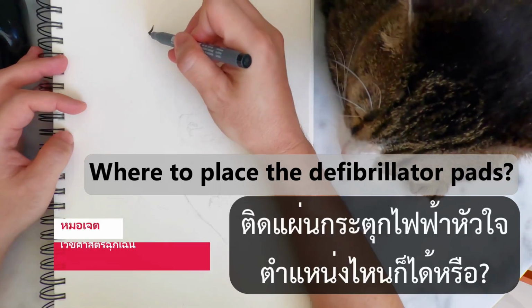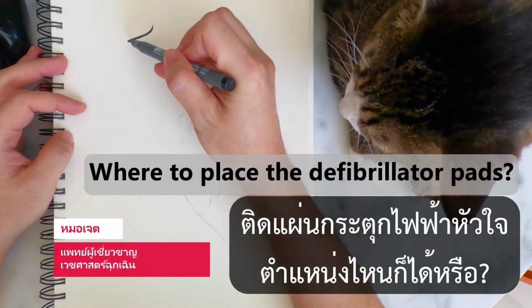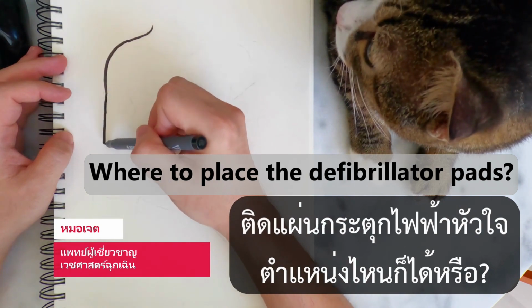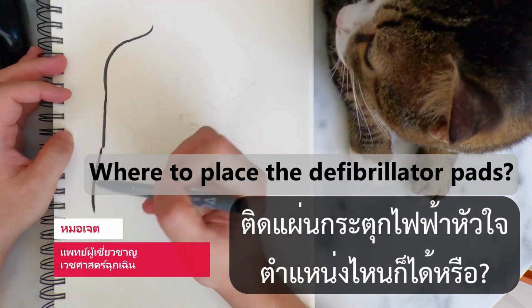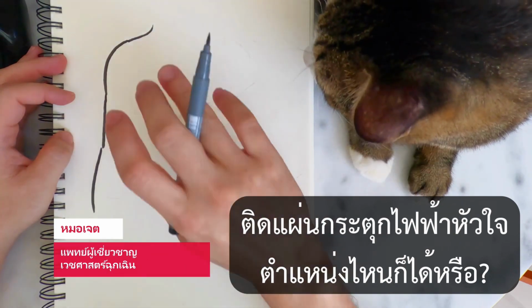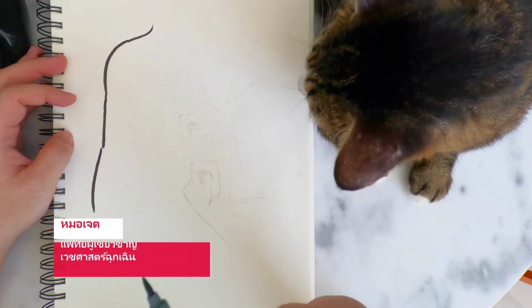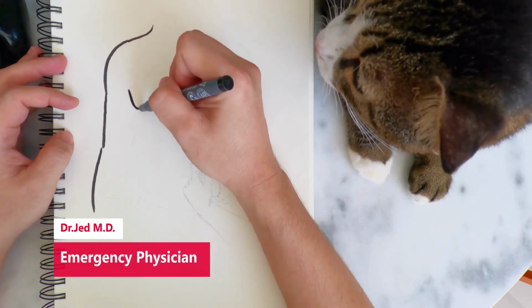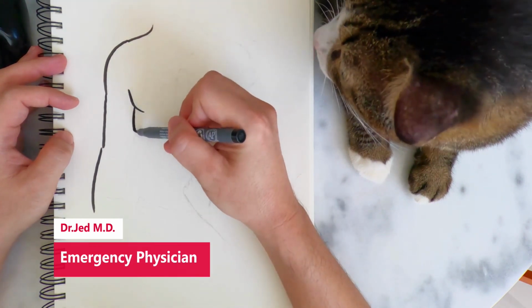The question is about the use of a defibrillator. They are wondering where the pads we use on the chest for delivering electrical shocks can be placed. You've seen, right, that there are pads that indicate where to place them. When a patient has a heart rhythm disturbance and is unconscious with no pulse, we perform chest compressions.